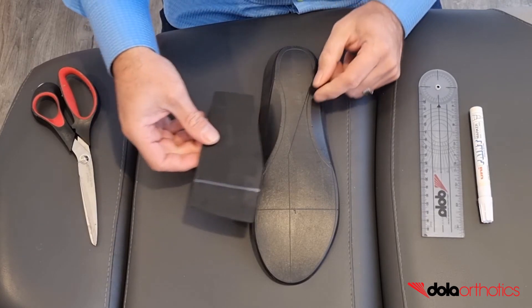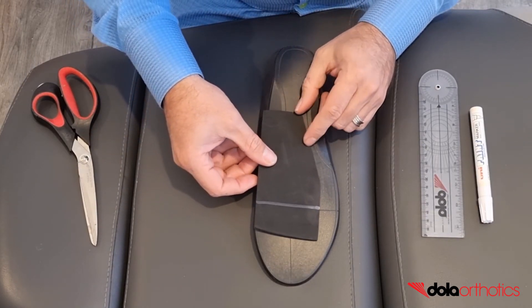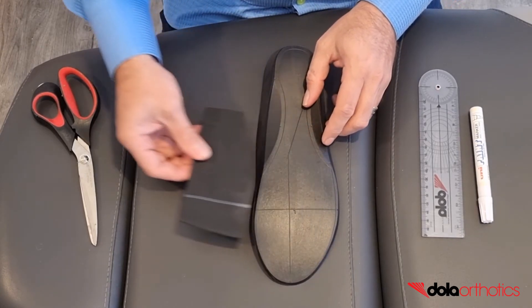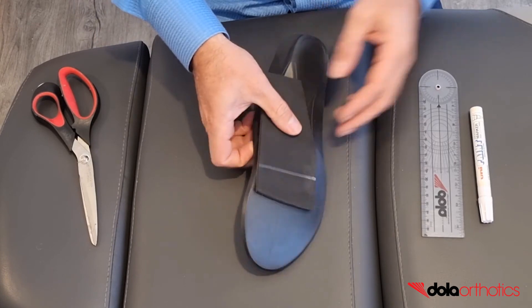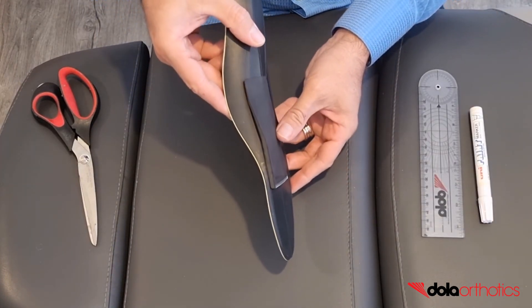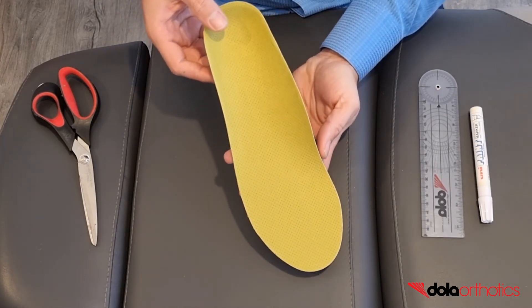For plantar application, start the proximal end of the wedge at the midfoot and extending under metatarsals 1-4. Mark the distal end at the required length to sulcus or beyond and trim with scissors. Using the self-adhesive 3M backing, place on the plantar surface with the wedge thicker medially and cover for dispense.